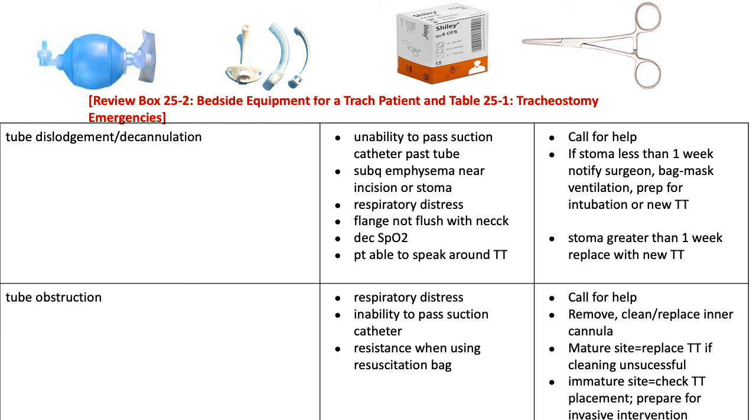Remember, that's the liner that collects all of the mucus or whatever happens to be in the tube. If it's a mature site, its tracheostomy tube's been in place for more than a week, you can try to replace the tracheostomy tube if cleaning is not successful. That's if you've been trained on how to replace the tube. If it is an immature site, less than a week, check the placement. You have to notify the provider and prepare for invasive interventions such as intubation or for the provider to insert a new tracheostomy tube.